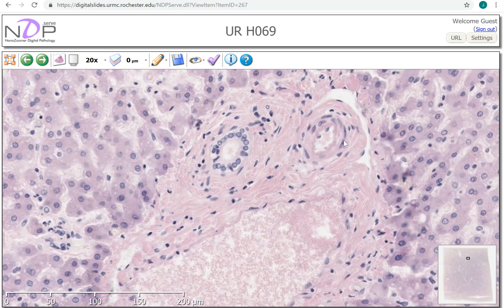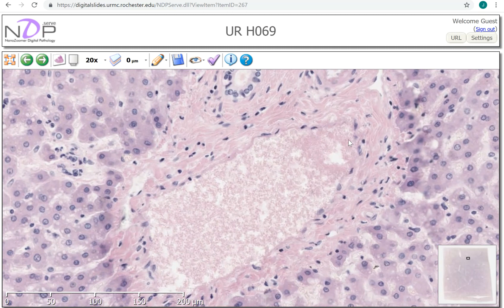What is similar in size to the bile duct is the artery. How do we know it's an artery? It has that thickened muscular wall. These are branches of the hepatic artery that we see in the portal tracts.